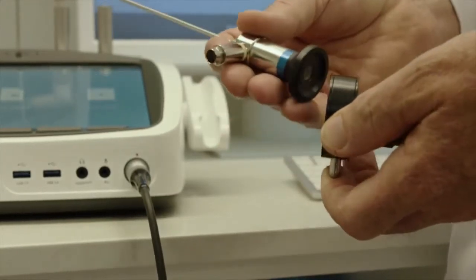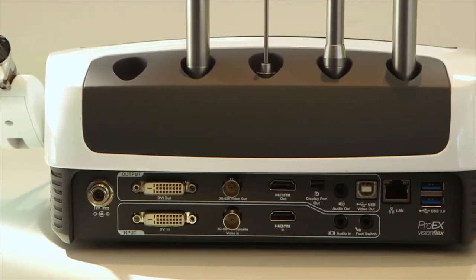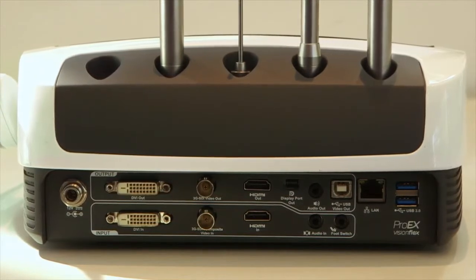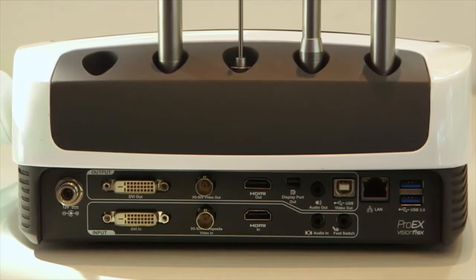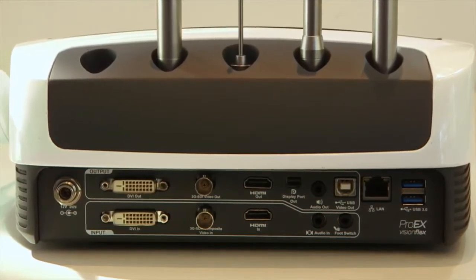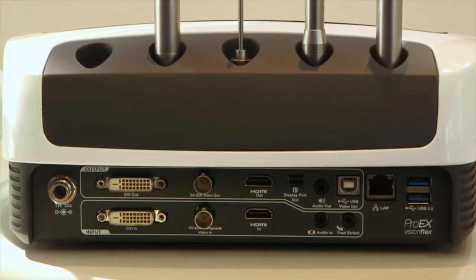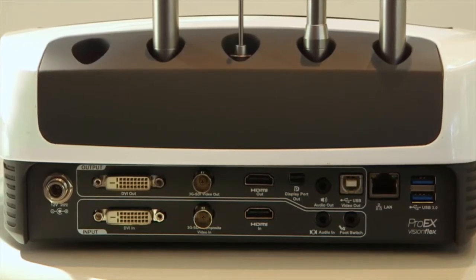The Pro-EX is also equipped with high definition DVI, SDI and HDMI video inputs for connectivity to third party systems such as slit lamp cameras, endoscope cameras or ceiling mounted patient monitoring cameras. The Pro-EX also has HDMI, display port and HDMI video outputs for connection to multiple monitors simultaneously.